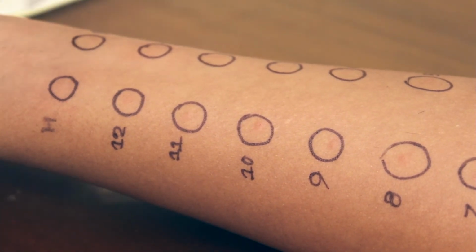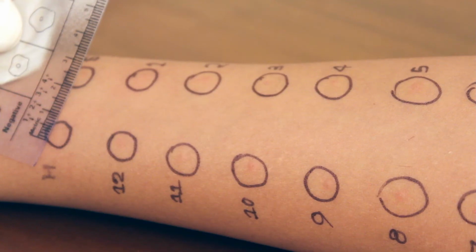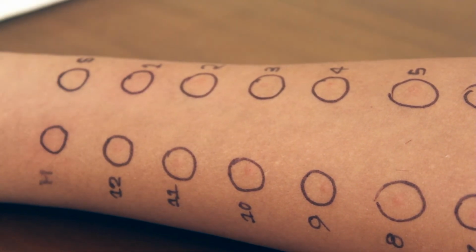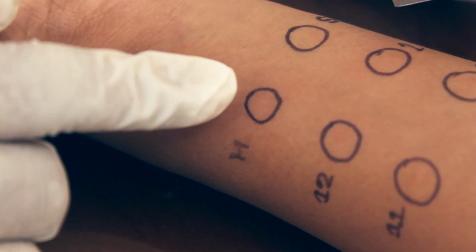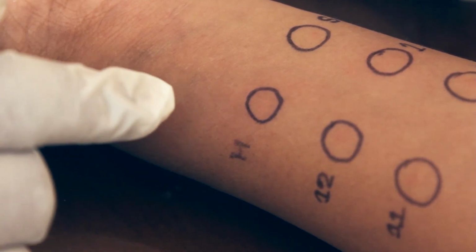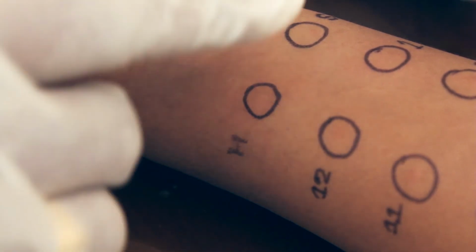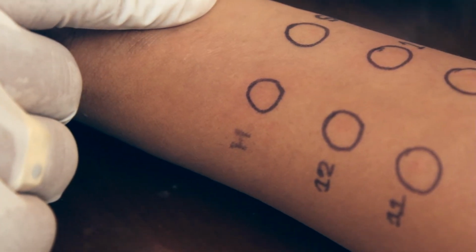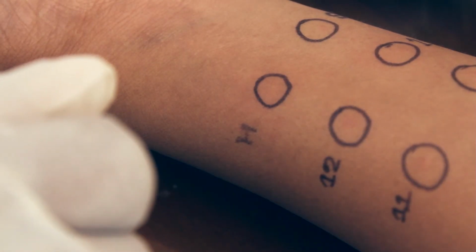So I start by measuring the size of the histamine reaction. You can see the reaction at the histamine site is 6 millimeters. The saline has to be negative. These reactions are seen in the form of a wheal and a flare, and the wheal is taken as the measure of the reaction. You can see different allergens show different sizes of reactions, and certain allergens do not show any reaction.